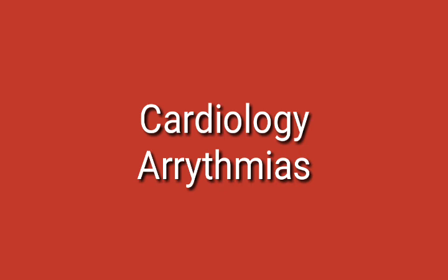Another feature of Mobitz type 2 is that it's often seen together with a bundle branch block. Remember, this is caused by disease in the His-Purkinje system, which includes the bundle branches. So often you see the AV block of Mobitz type 2 along with a right or left bundle branch block. And we'll talk later about right and left bundle branch blocks, but for our purposes here, if you have one of the bundle branches blocked, you will get a prolonged QRS interval. And you see that in this tracing at the top of the screen.